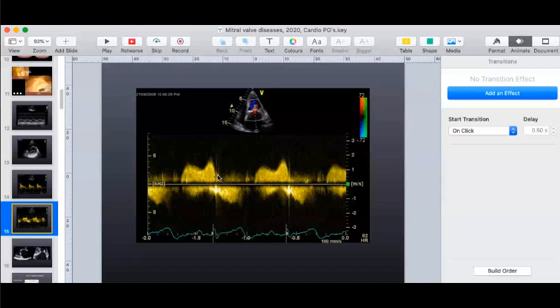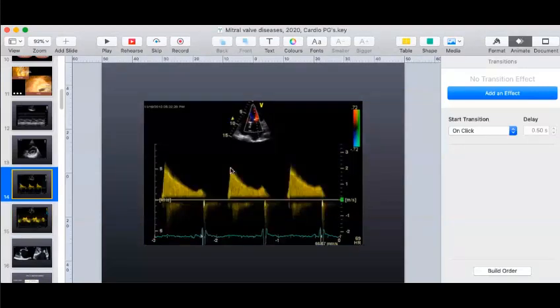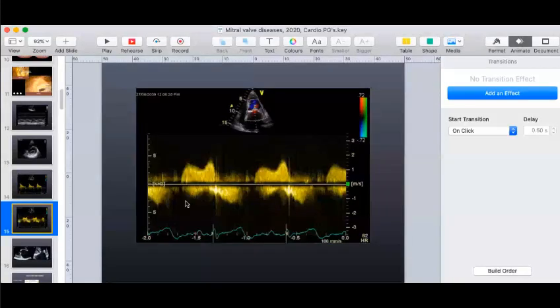So in this spectral Doppler, when you compare with this, you have an E which is very tall and an A which is very small here, the last part of the profile. But in this, it is the other way around. So in this profile, what should be interpreted is that this is a mitral stenosis patient, but which has got an LV which has got impaired relaxation abnormality. So this is diastolic dysfunction which is playing a role, and it is not allowing the early flow to happen.